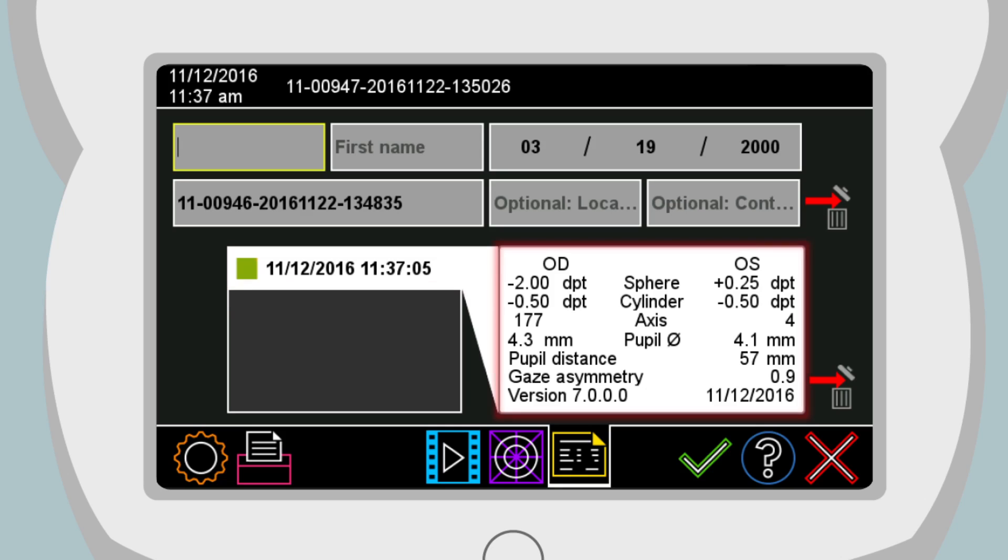The label can be viewed and printed again at a later time, and new measurement results can be compared to previous measurement results through the patient database.